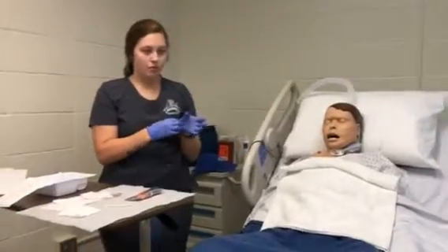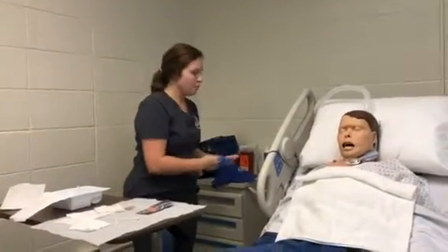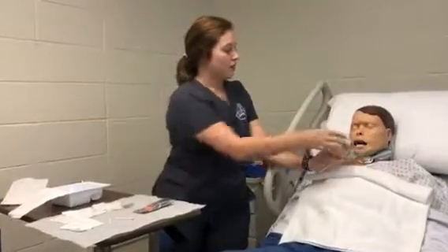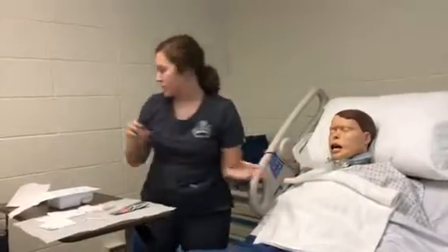So we are done with that portion. I'm going to go ahead and remove these gloves and wash my hands, put on clean gloves, and put the gauze back around. While I'm doing that, I'm going to put the oxygen back on, make sure that he gets hyperoxygenated.